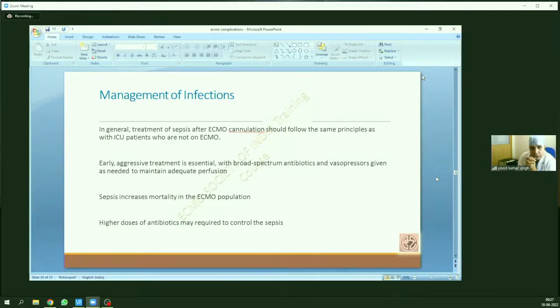Second, whether to change the membrane or the cannula or not is quite a challenging situation, and it is totally dependent upon the ECMO specialist, if these systems like the oxygenator get colonized, particularly with Candida, and repeated Candida cultures are coming positive.